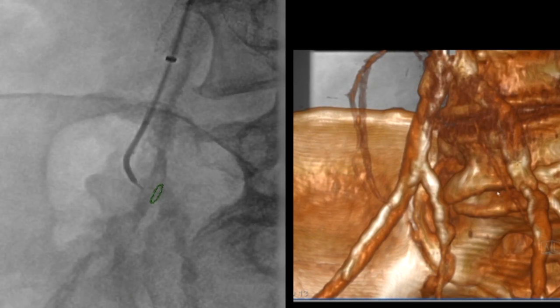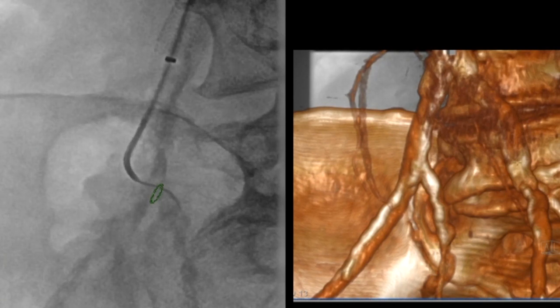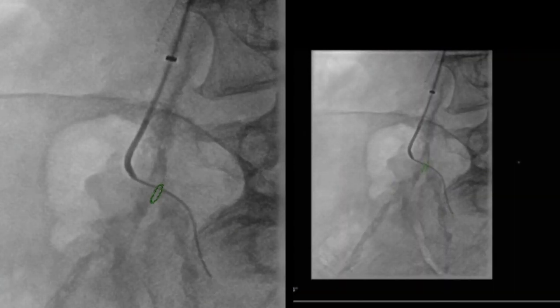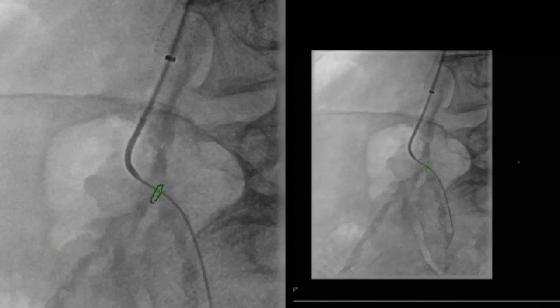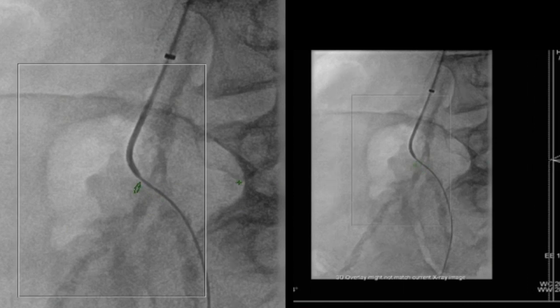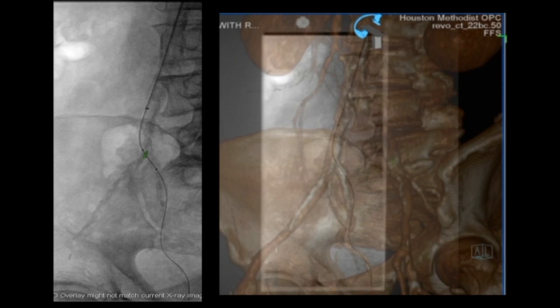We then approached the right side and it took some time. However, again using a fused image, we marked what the origin was and we managed to get a wire which went down through this somewhat small and occluded internal iliac artery and we advanced this down into the pelvis. Over this, we advanced the catheter and confirmed that we are in fact endoluminal. We opted at that point to dilate the origin, placing a small 4 millimeter balloon at the origin and switched out to a stiffer wire placed down in one of the branches of the internal iliac artery.